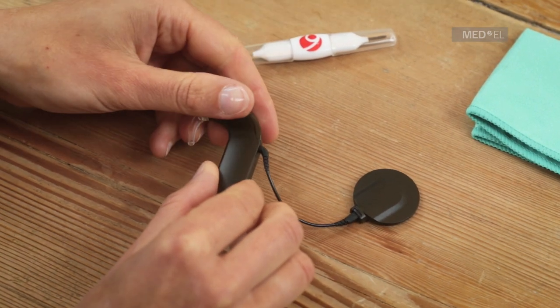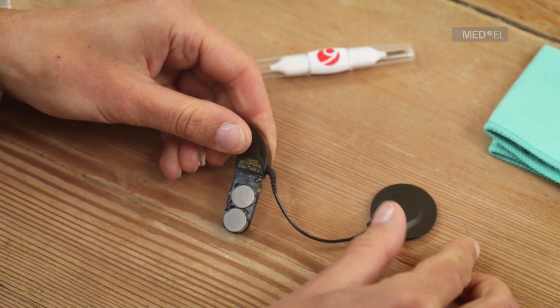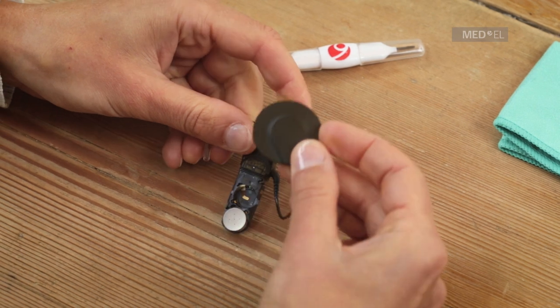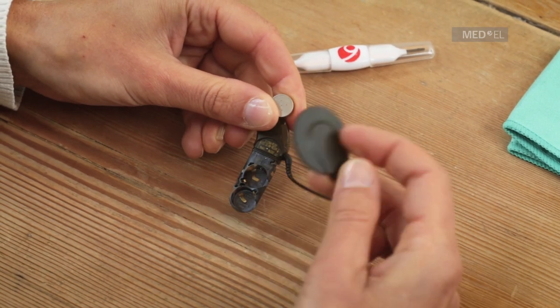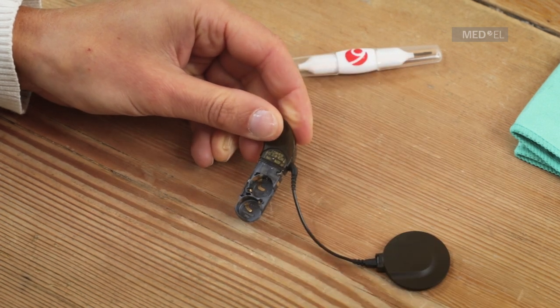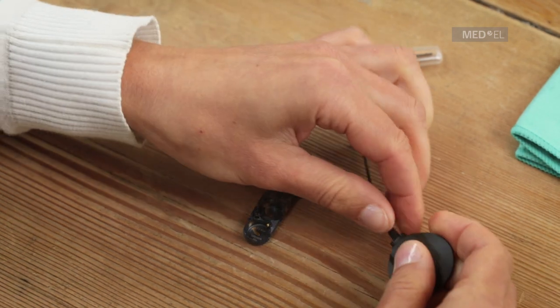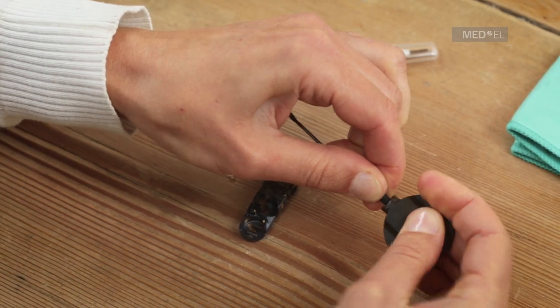To disassemble the sonnet, first remove the battery pack cover. Next, take the batteries out of the frame. Then unplug the coil from the coil cable and unplug the coil cable from the control unit. Separate the battery pack frame and the control unit by pressing the tip of the release lever.